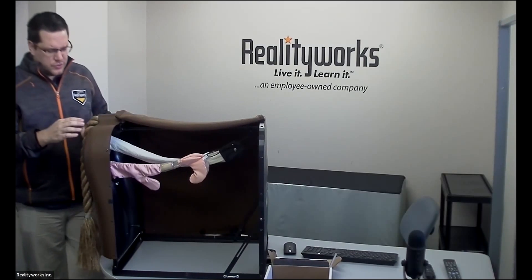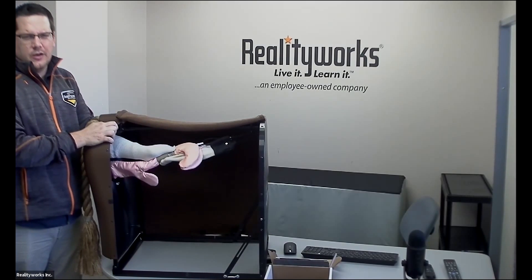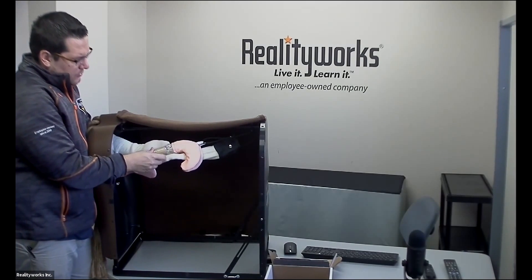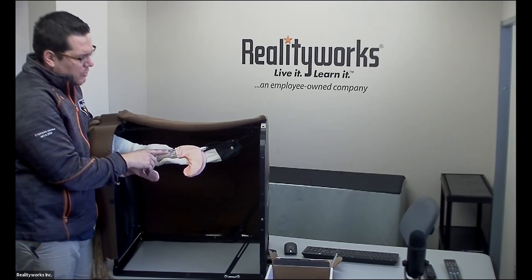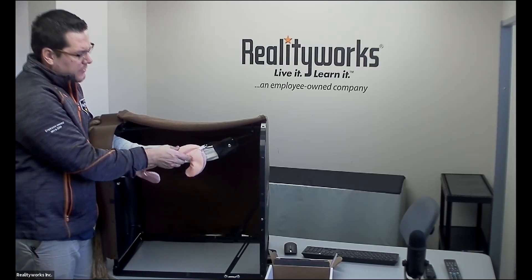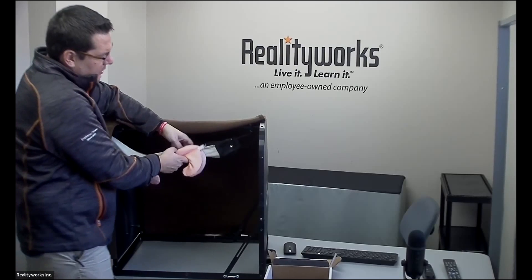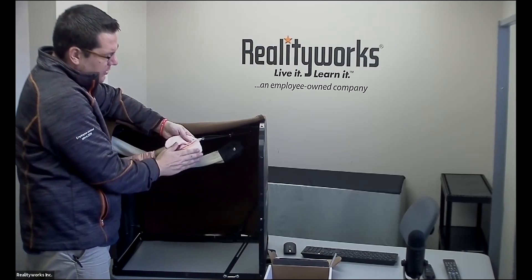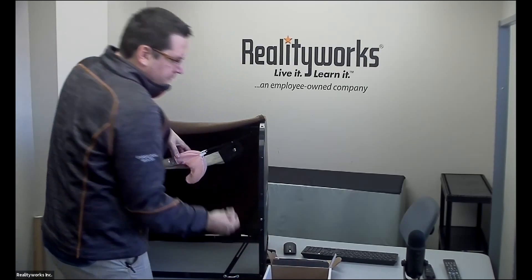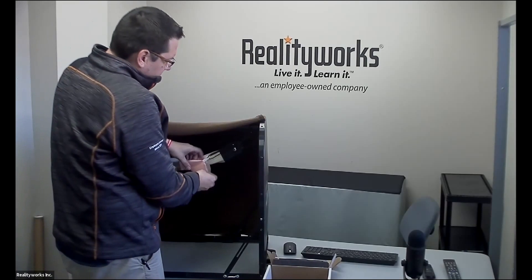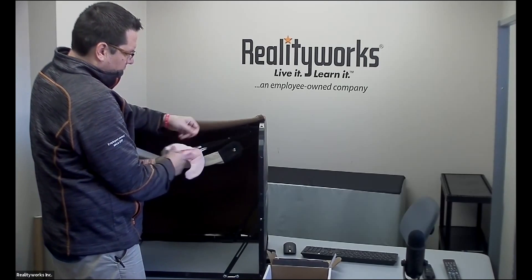That allows you to get inside and actually feel around and get to the uterus of the cow. We have the uterus here, and inside it has the cervix — a clear cervix — so you as an instructor can see if the student is artificially inseminating in the correct place and can get past the cervix. Inside here, we have the uterine horns, which have pouches where you can place CL1, CL2, and CL3 all the way down to where the ovary is located.